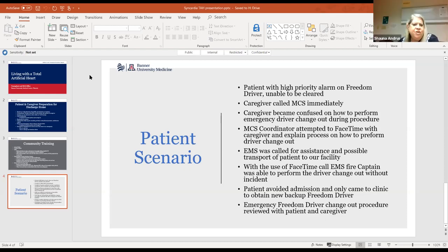Gotcha. Mel, I've had two. One was halfway around the tubing. It wasn't all the way through, but it was halfway. It was below the wire at the natural bend. We started protecting it with perfusion tubing to hold it stiff at that natural bend point.